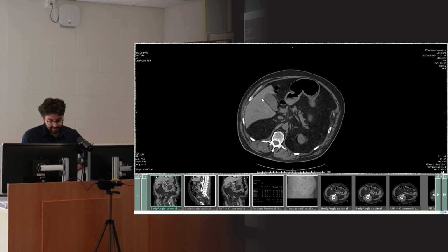So I'm talking not about contrast in the image, I'm talking about IV contrast. IV contrast medium contains a lot of iodine. Iodine is quite low down the periodic table, therefore it is very dense. Anything that is dense is bright on CT and plain film. So if you inject someone with iodine-based contrast, the organs that the contrast ends up in will enhance, which means they will get more dense.